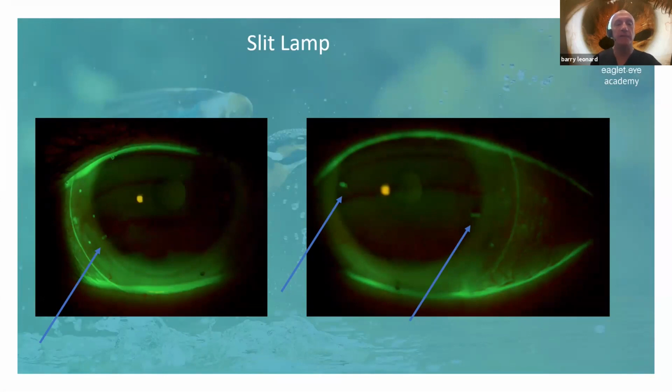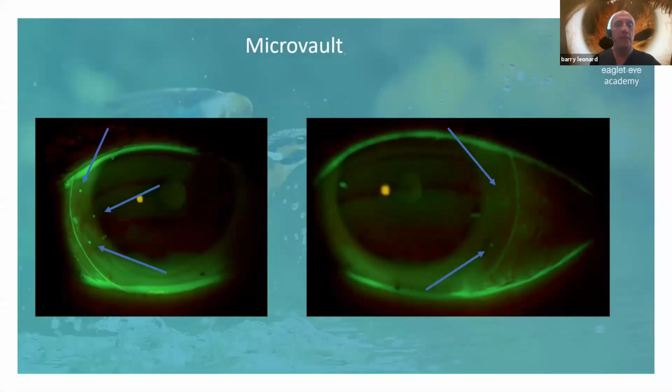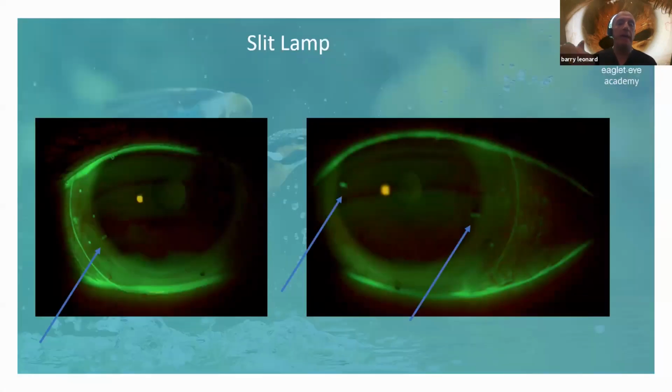So this is now the Zen lens on the eye at a follow-up visit after we'd gone ahead and put the microvaults. But you can see the other slide was pointing to the hash marks. And what was interesting, if you look where that's aligned, and if you went back to the Eaglet, which we don't need to, it'll predict the axis of the flat meridian, and it was almost exactly there. And it lines up.